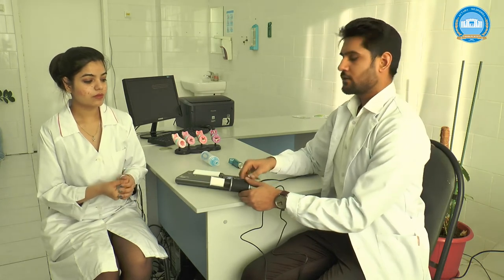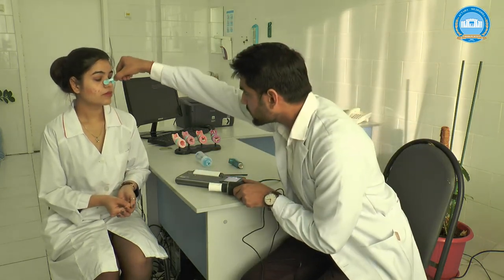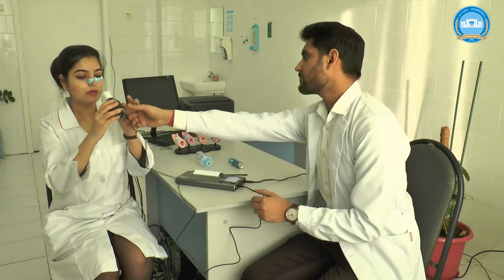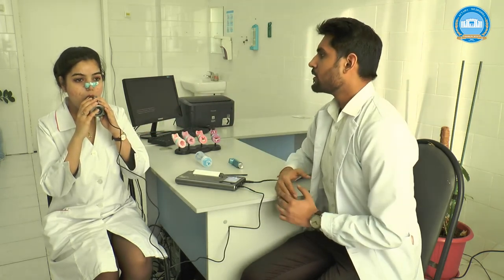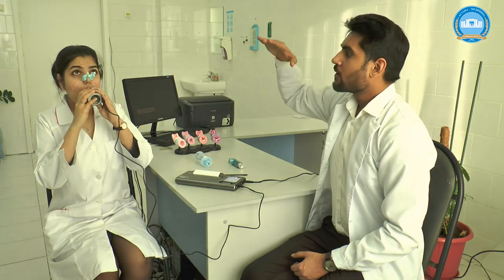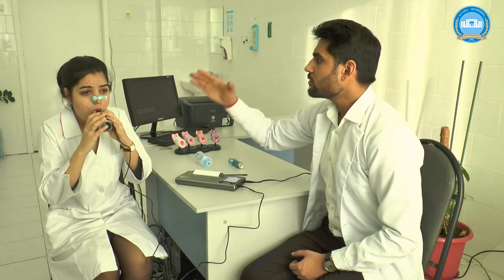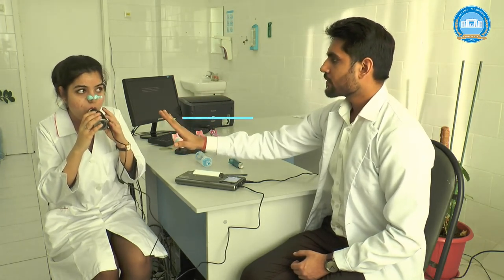Install the nose clips — breathing should be reproduced through the mouth. Hold the mouthpiece tightly with your lips and teeth to prevent air leakage. After a calm exhalation, take the deepest possible breath and immediately, without pausing, exhale all the air with maximum effort, continuing until the lungs are completely emptied. Exhalation ends at the doctor's command.